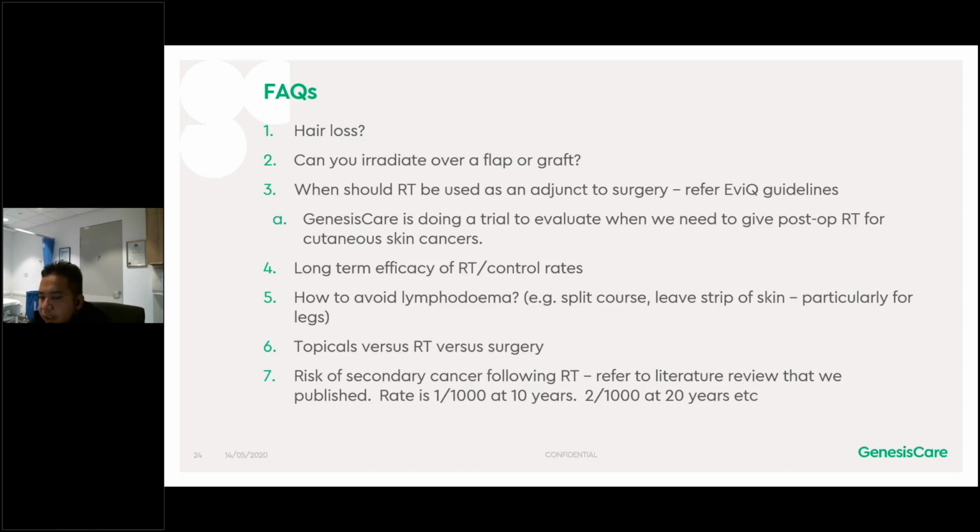But otherwise, if patients have skin cancer all over the scalp, and they've got a bit of hair at the front here, you've probably seen examples where we will probably not be able to keep those hair follicles that sit in between the skin lesions.